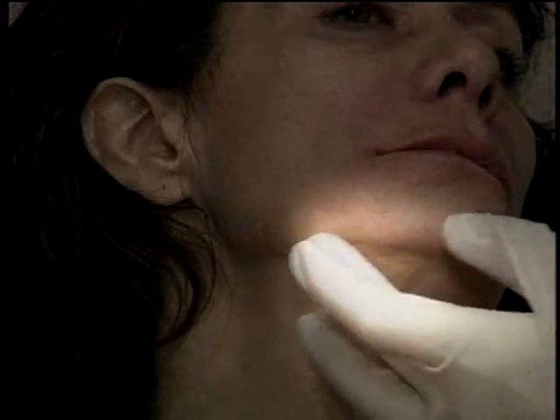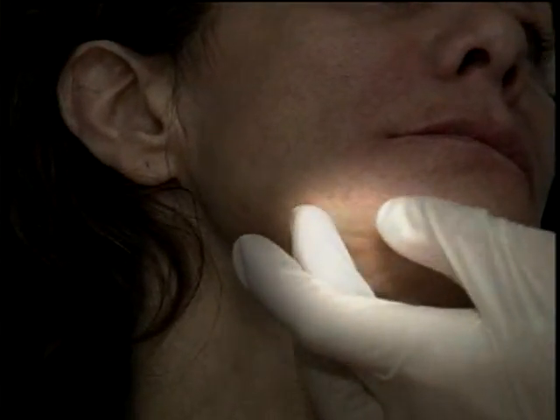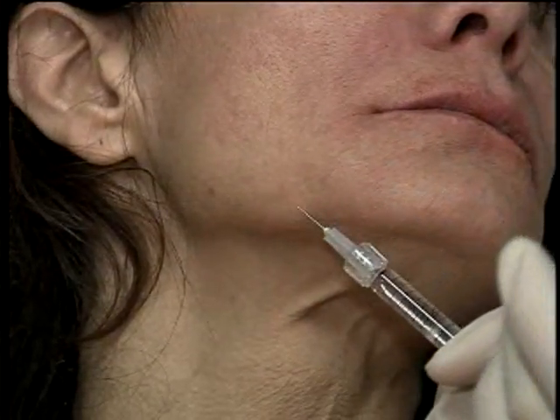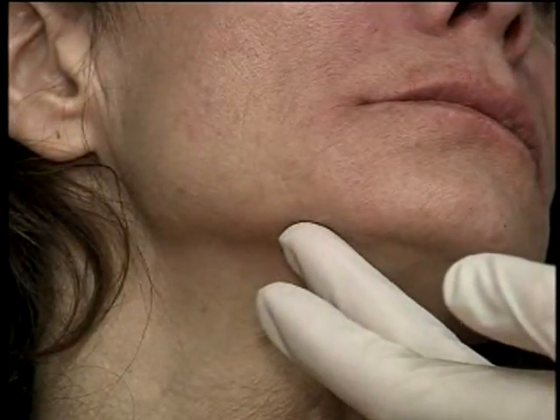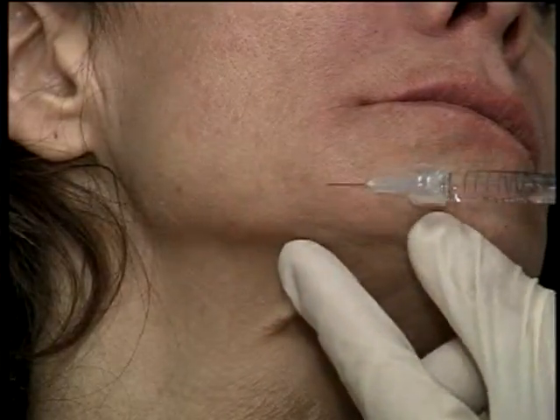So the pre-jowl sulcus is right in this area right here. Here's the jowl, and this is the pre-jowl sulcus. So this is another area that we will treat. When we treat this area, you want to make sure you get underneath the border of the mandible, because you have to put a little bit underneath here to make sure you treat it appropriately. Now she doesn't have significant pre-jowl sulcus, so we'll just put a little bit in there.